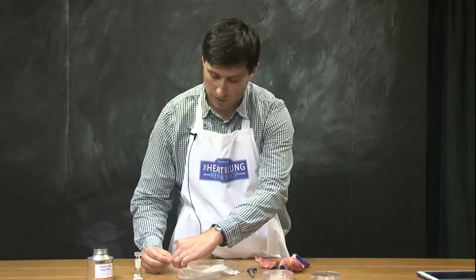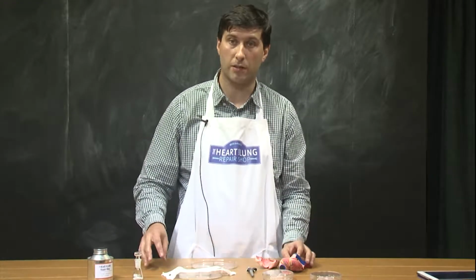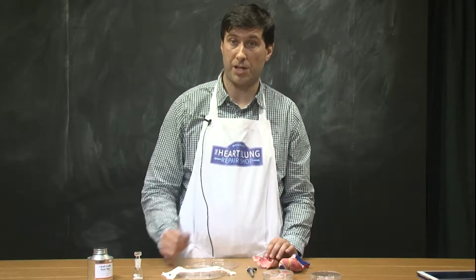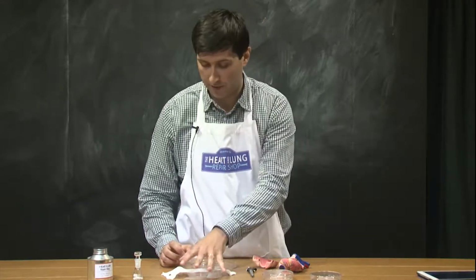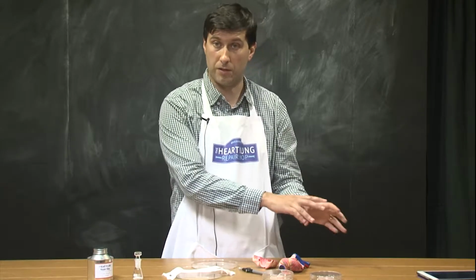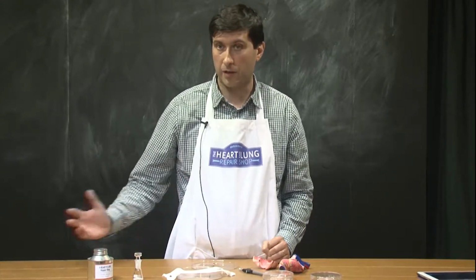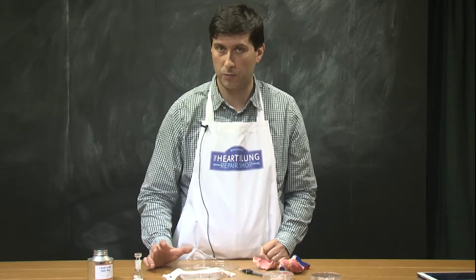The idea is that we can use stem cells from the same patient who is going to undergo the transplant, and in this way we can avoid rejection of the valve. So we take the stem cells from the patient, put them into our scaffold, and then transplant this into the patient. Because the material is biodegradable, in time it will be degraded within the body, and the cells inside will replace it with the proper tissue.